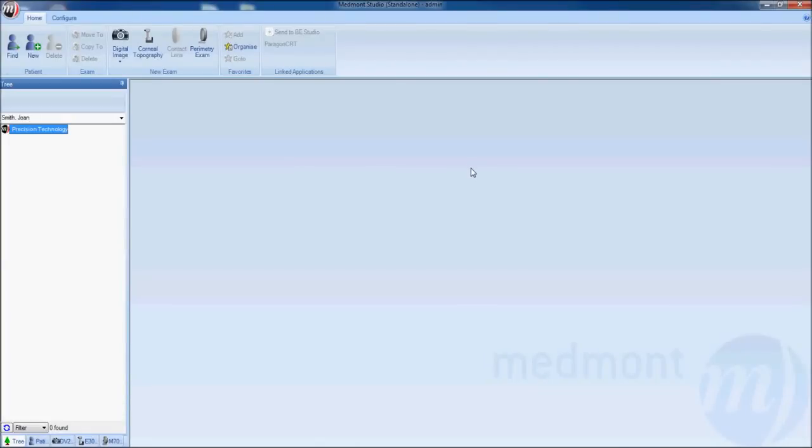This is video 3 on the fundamentals of capture with your MedMont E300 corneal topographer. Start by creating a new patient. Click on the home and then new.